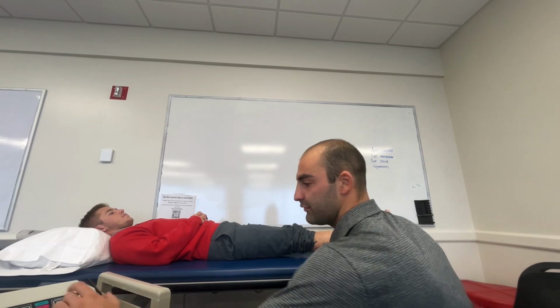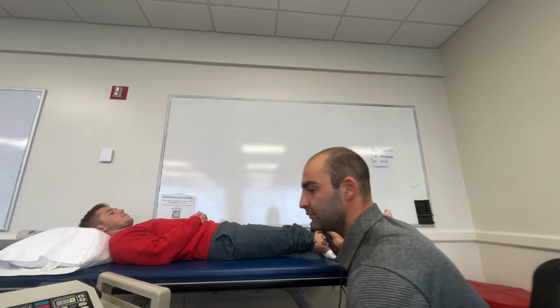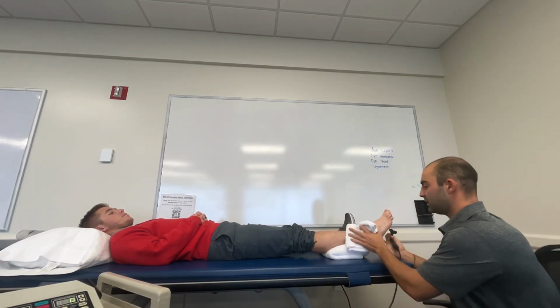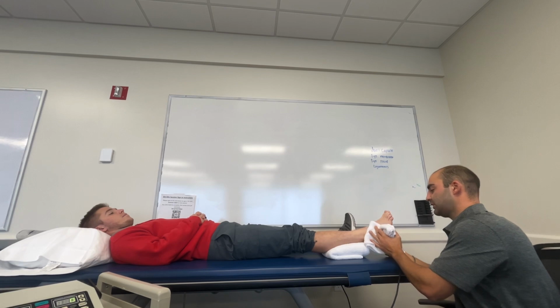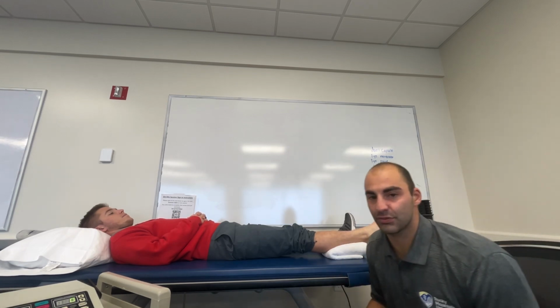So our 8 minutes are up, and I do have to ensure that our ultrasound machine is off before I remove the head from application. How'd that feel? Felt really good. Okay, awesome. Now we'll remove the gel from the patient, and we always reassess the area that we're treating to make sure that there was no redness or significant irritation or increased swelling in that area.